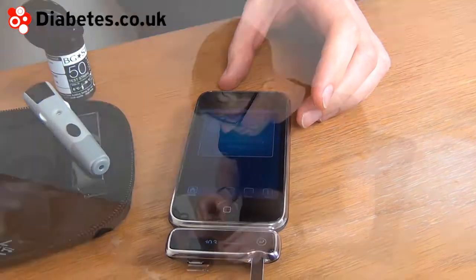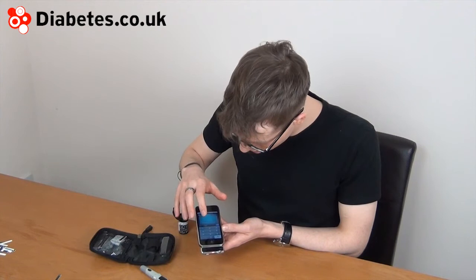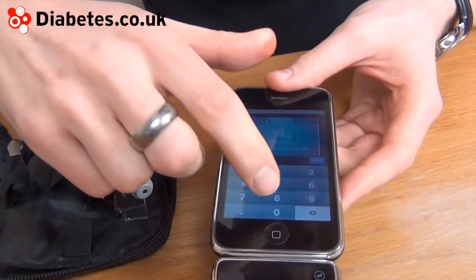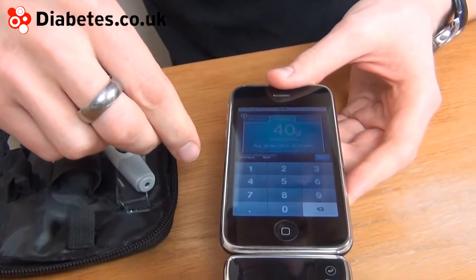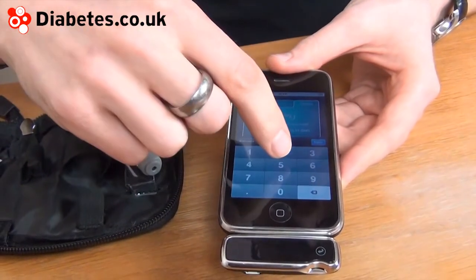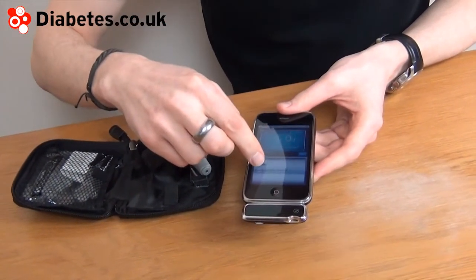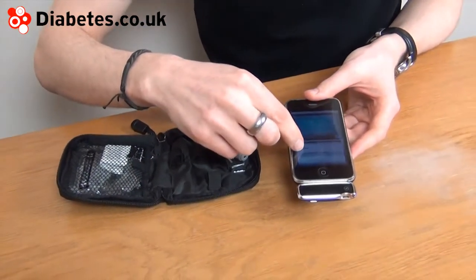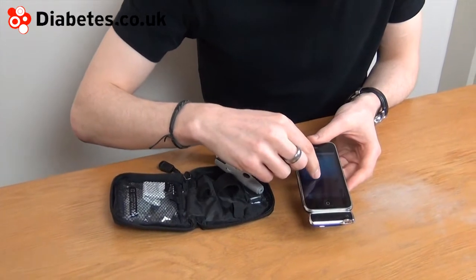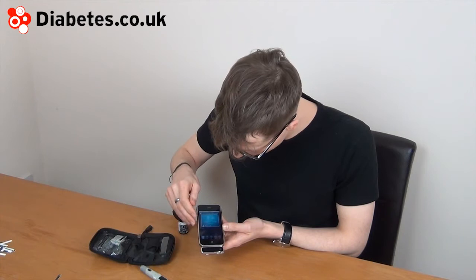So a little on the high side for me. The beauty of the machine is that you can add in how much carbohydrate you've had — let's say about 40 grams of carbohydrate. And for that, we'll have five units of insulin. You can change which type, whether it's long-acting, premixed, or rapid-acting insulin. We'll say rapid-acting here. There's also a chance to add a note, and all of that will be noted in the diary.